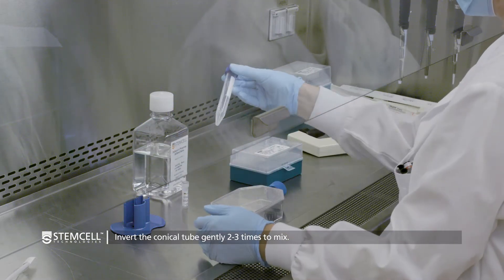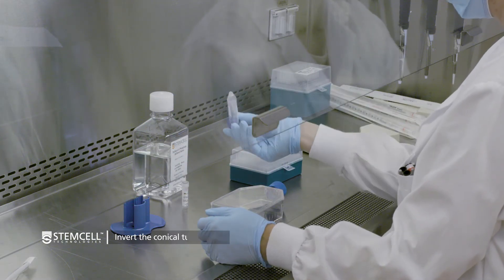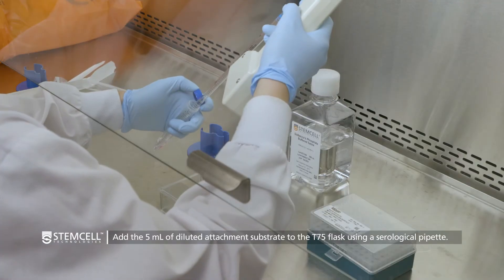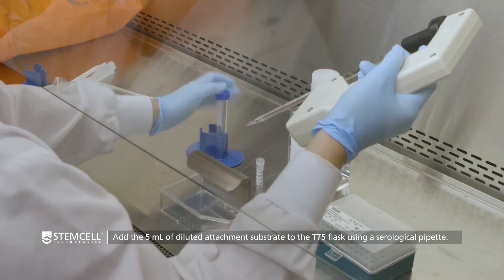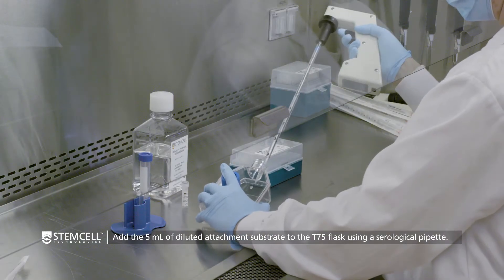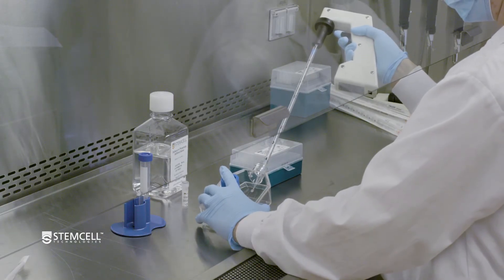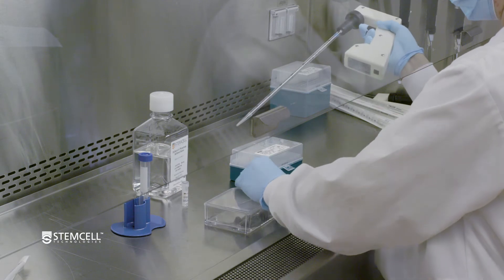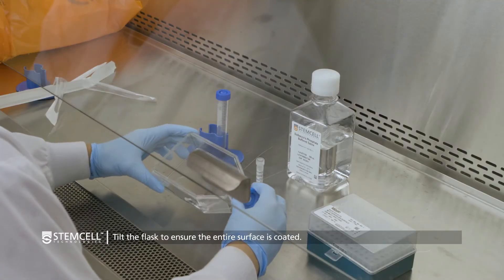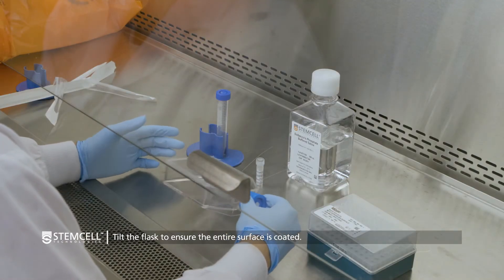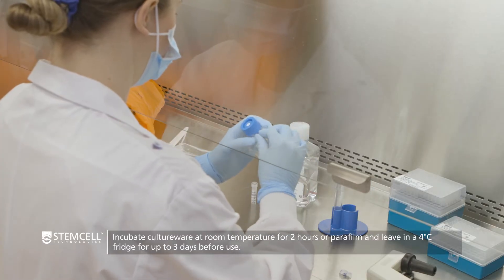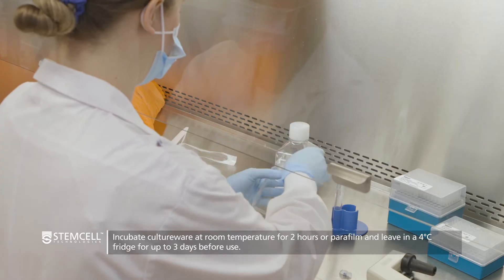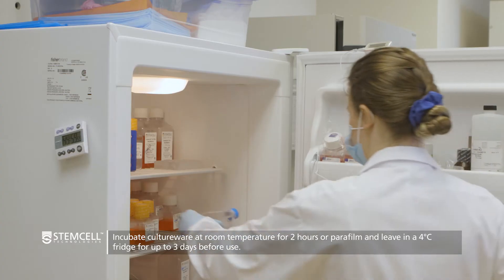Invert the conical tube gently two to three times to mix. Add 5 milliliters of diluted attachment substrate to the T75 flask using a serological pipette. Tilt the flask toward the corner to ensure that the entire surface is coated. Incubate at room temperature for 2 hours or parafilm and leave in a 4 degree fridge for up to 3 days before use.